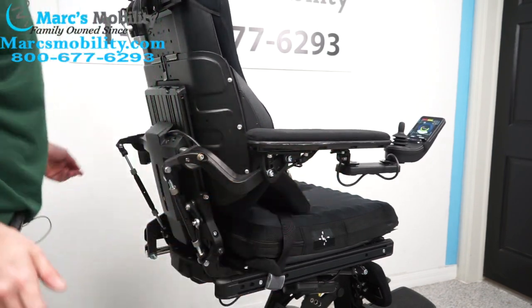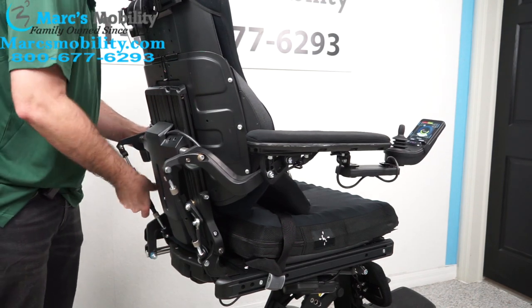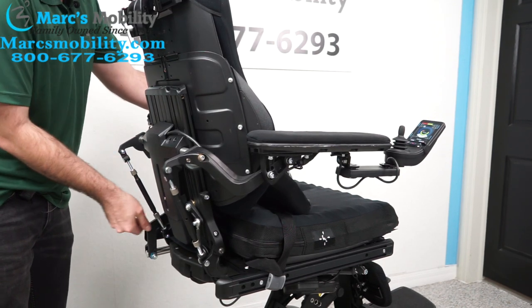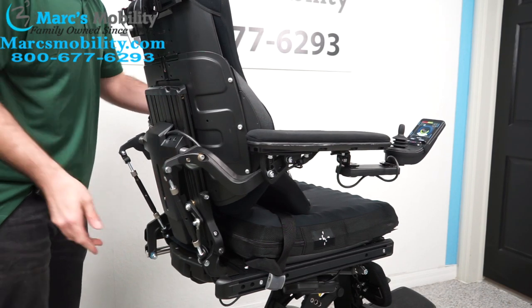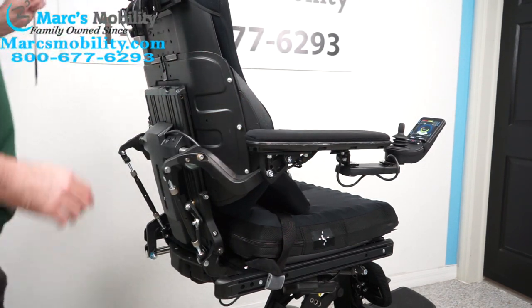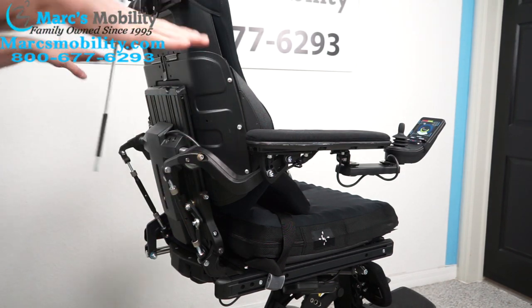Now that looks a little more normal. I'm going to do that to both sides. Again, taking the weight off the arm makes it a lot easier — just hold it in your hand. When you have them both at a comfortable height, if you need it to drop lower, just go through the top again, and then tilt the arms back up once they drop down.